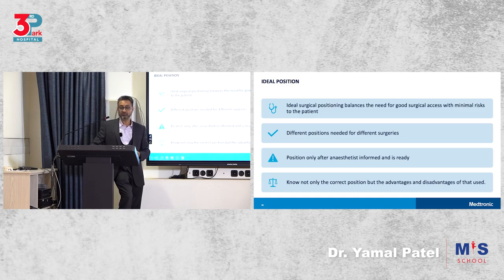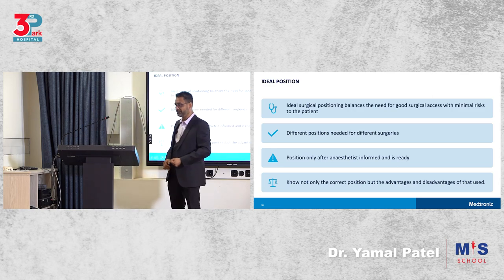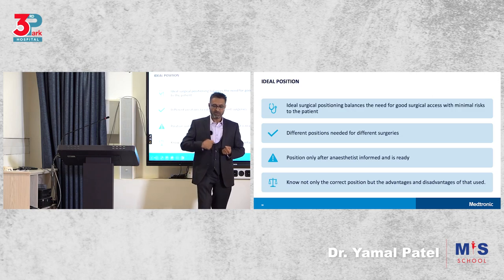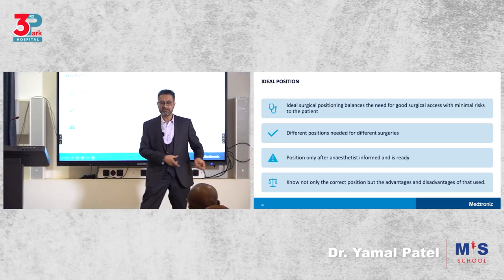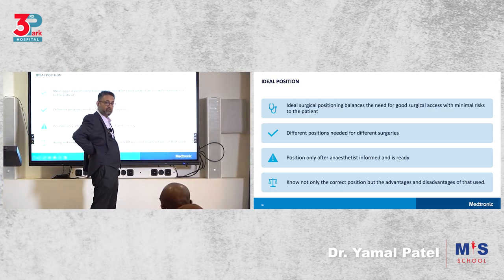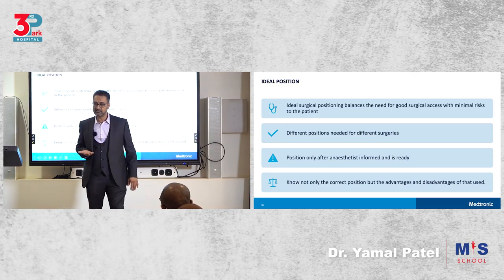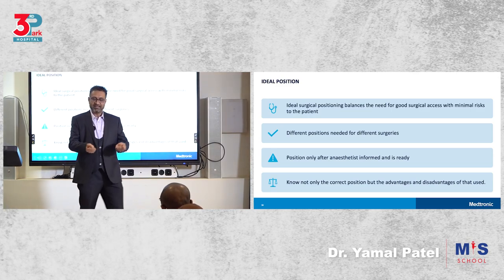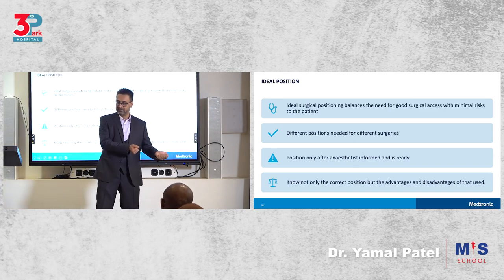Different positions are used for different surgeries. The positioning should only be done after an anesthetist is informed and is ready and is moving. The positioning is done at least with 1, 2, 3 assistants. You don't do one person and pull it. The positioning is not done by just pulling the sheet and doing that. You'll cause friction burns when you sometimes slide off the sheet from under the patient. So you have to lift and move, not stretch and move. Okay, that's how positioning is done.